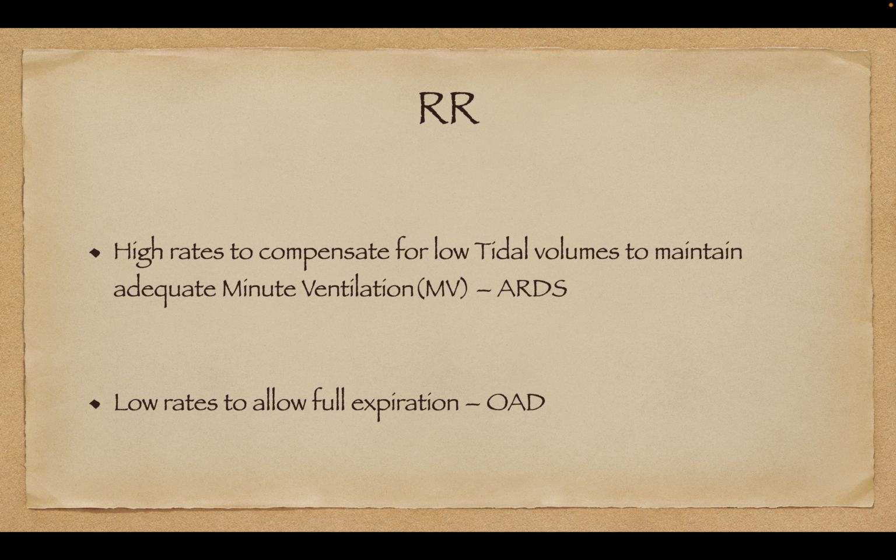The next is respiratory rate. High respiratory rates are used to compensate for low tidal volumes in patients of ARDS, and low rates to allow full expiration, especially in patients of obstructive airway disease.